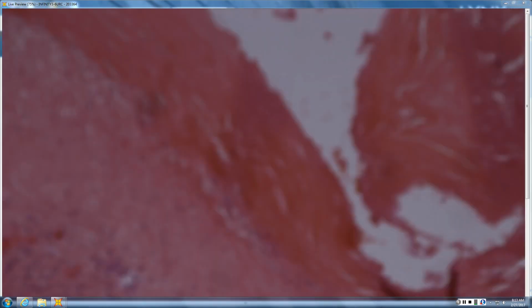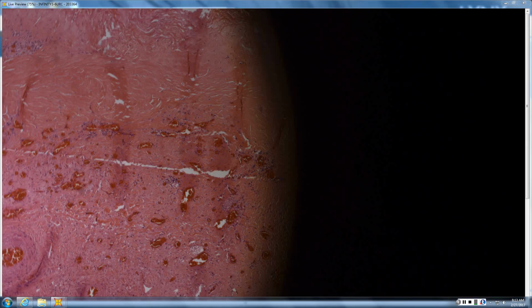Is there a clue, when there's no history of vaccination, how to tell it apart from chickenpox in a child? Eczema vaccinatum, oh, I see. Chickenpox tends to be tighter, smaller vesicles. You have a little more of a vasculitic response, but not as much as zoster. But you can do PCR or you can do DFA, direct fluorescent antibody, and you can do it on your biopsy, on the tissue. So that often leads to the diagnosis there.